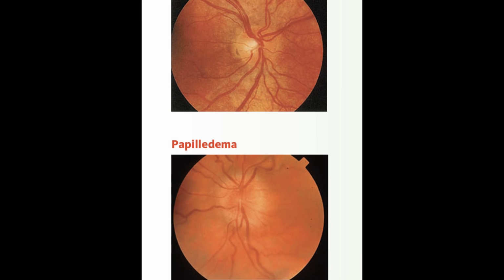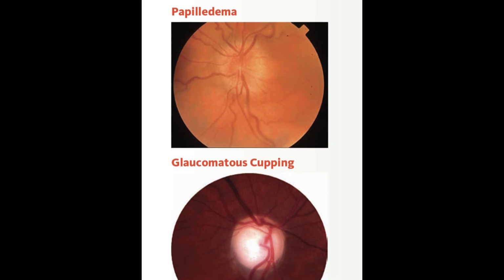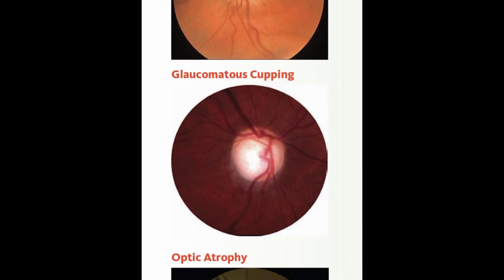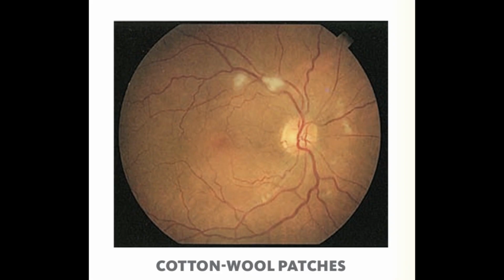Inspect the optic disc. Note the following features: the sharpness or clarity of the disc outline, the color of the disc, the size of the central physiologic cup, and the comparative symmetry of the eyes and findings in the fundi. Papilledema describes the swelling of the optic disc and anterior bulging of the physiologic cup.